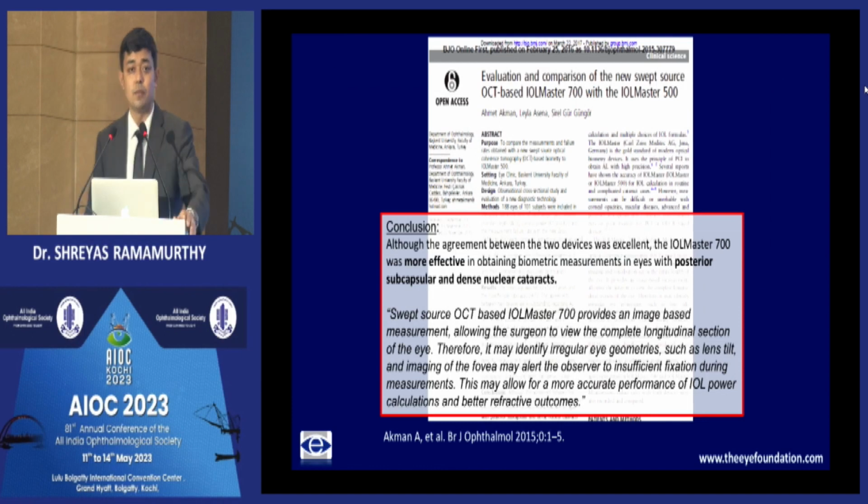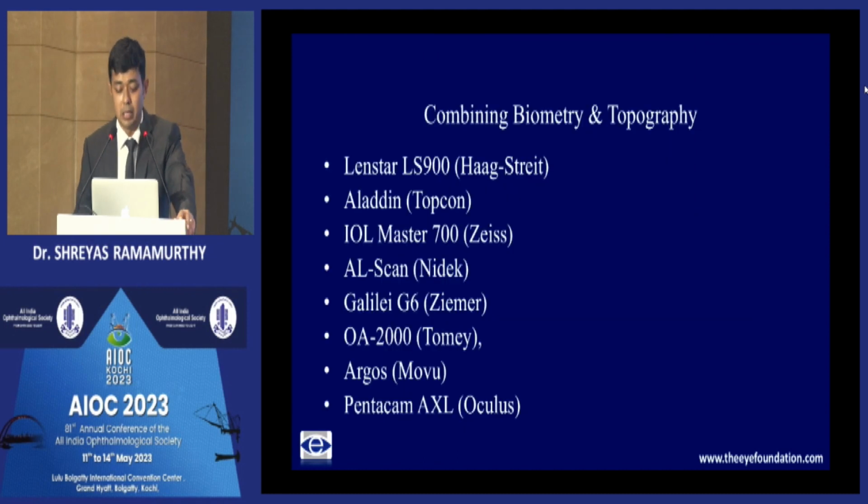The penetration of these swept source OCT devices is also much better, and there are very few cataracts nowadays that you're having to shift to the immersion. Most of them we are able to do with the optical biometer.